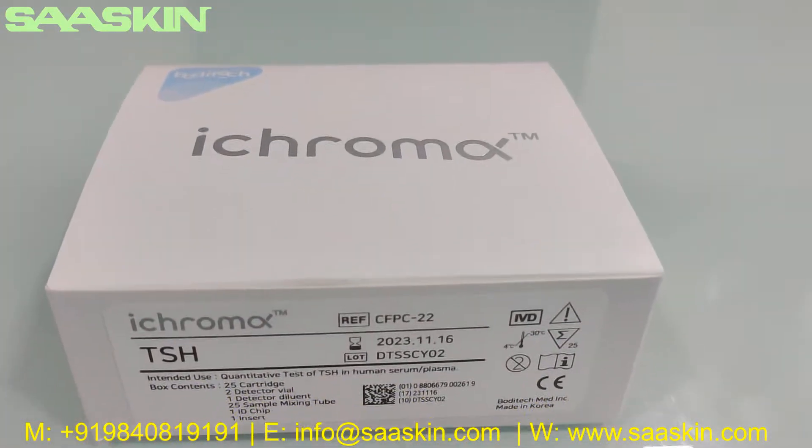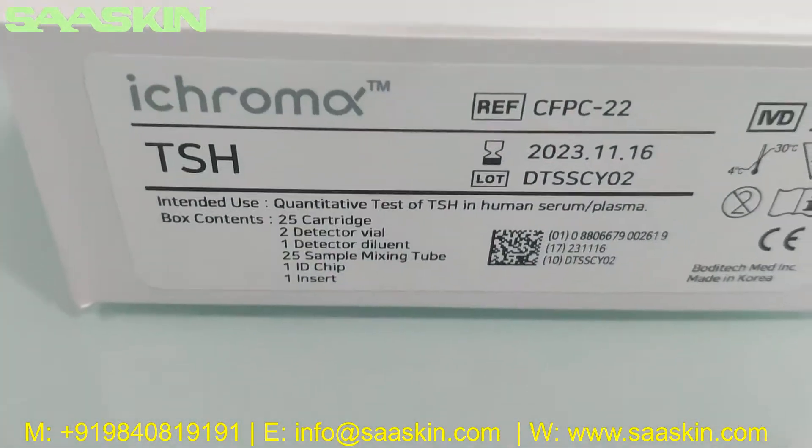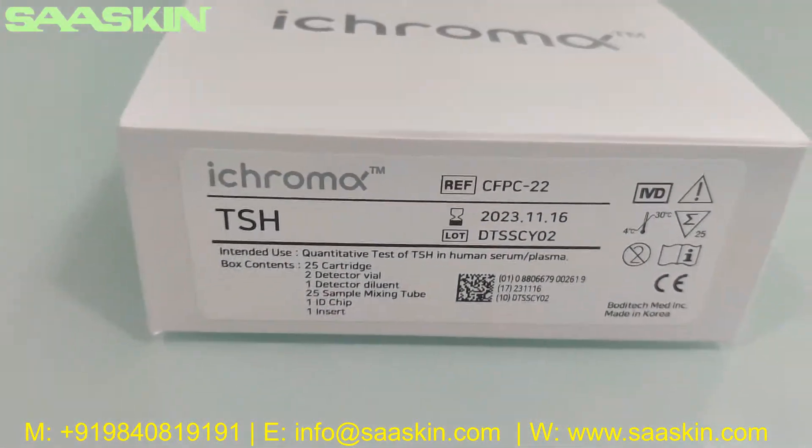Hello everybody. Today we are going to see the unboxing of Boditech iChroma TSH Test Cartridge Kit.